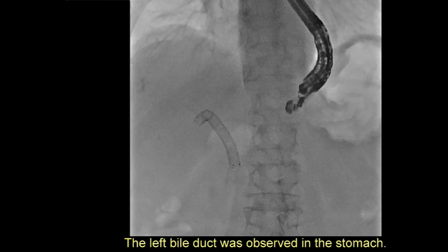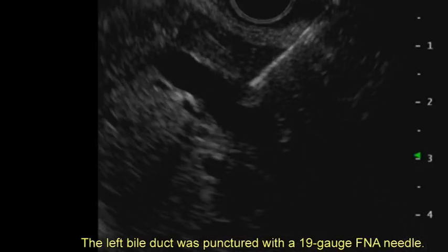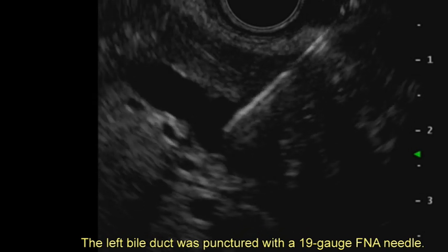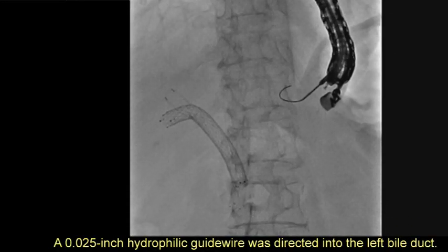The left bile duct was observed in the stomach. It was punctured using a 19-gauge FNA needle, and a 0.025-inch hydrophilic guide wire was directed into the left bile duct.